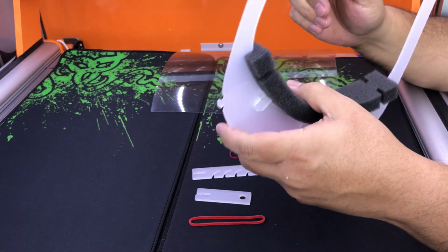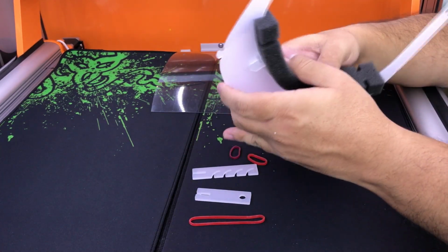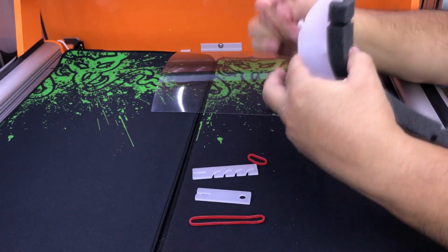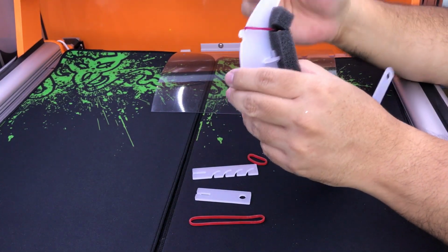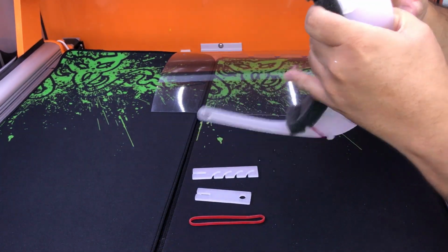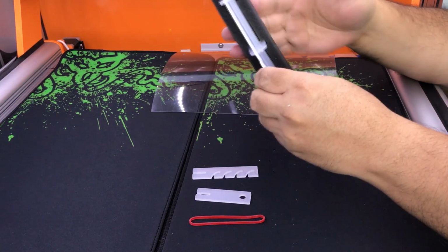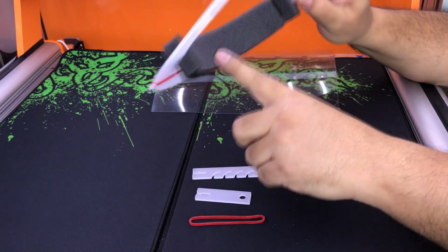Now, there could be the possibility that this can get loose, so that's why you need the small rubber bands to put them here against this cut. So it's very simple. You grab the rubber band, you open the rubber band, you put it here, and that's it. It stays in place. Now the other one, do the same. Open the rubber band and it stays there. So that's very simple, very easy, and it stays in place, and you can put it on your head.